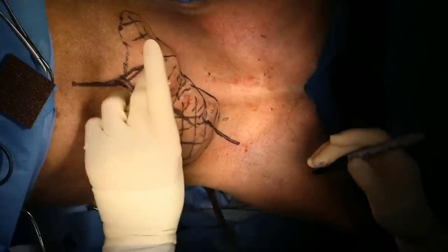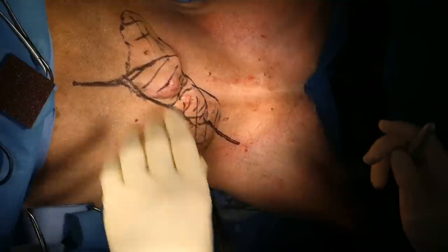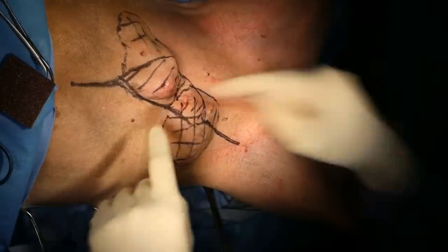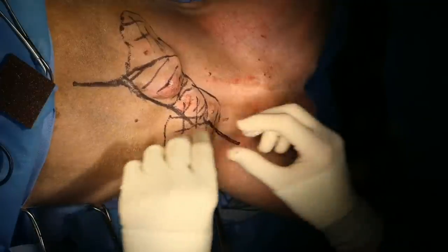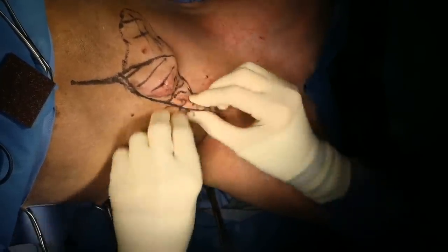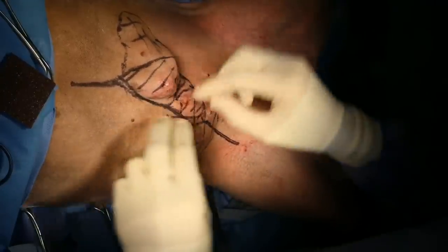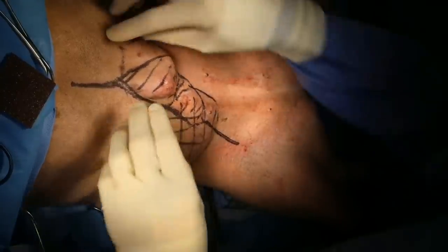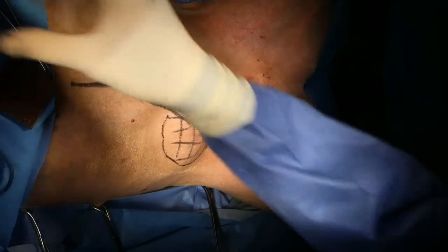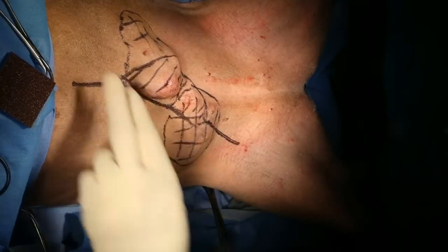And biopsy was done, which revealed a grade 1 soft tissue sarcoma, which is great news for the dog because it's unlikely to metastasize. Now, normally we would have to excise all of this skin, but on this dog, on the CT scan, the skin is very isolated from the mass except for in a few areas here where the biopsy was performed. And so we're going to preserve the majority of the skin except for the areas where the biopsy was previously performed.